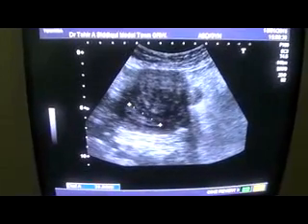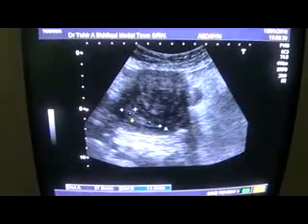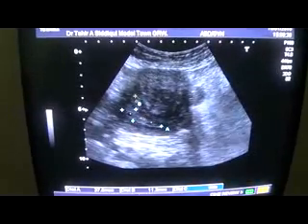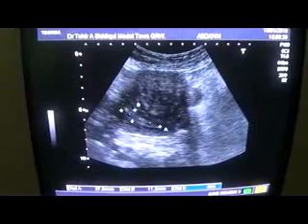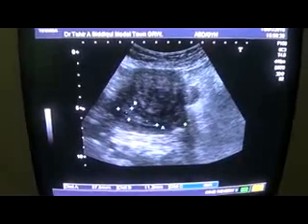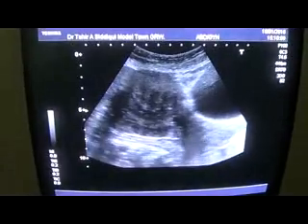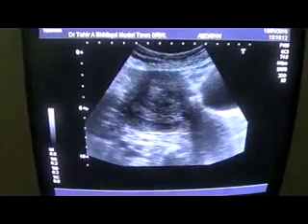As she is in the menopausal age, she does not give any history of menorrhagia, though we see mass effect from this fibroid. This is the fibroid, this area. There is a pressure effect on the endometrial canal, which is being pushed downwards by this solid echogenic mass, which is the fibroid. Okay, now moving further into the study, otherwise the endometrial canal is seen normal.